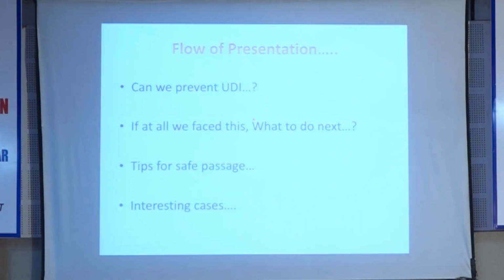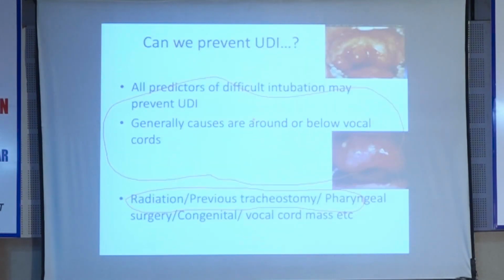So the flow of my presentation will be: can we prevent unanticipated difficult intubation? If at all we face it, what should we do? What are the tips for safe passage? And one or two interesting cases at the end. Now, can we prevent unanticipated difficult intubation?